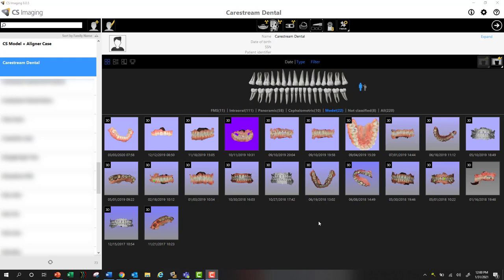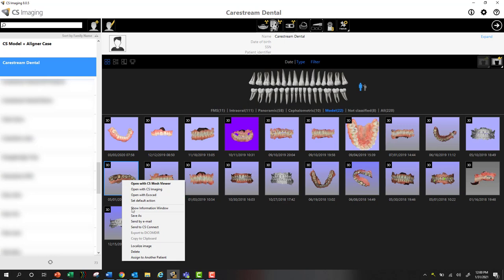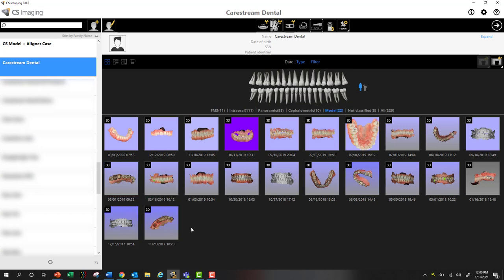I'm here in CSI 8, CacheStream Imaging version 8.0.5. I can launch CS Connect by right-clicking and selecting CS Connect right from here, or I can launch CS Connect directly from the ScanFlow software prior to saving my scan.